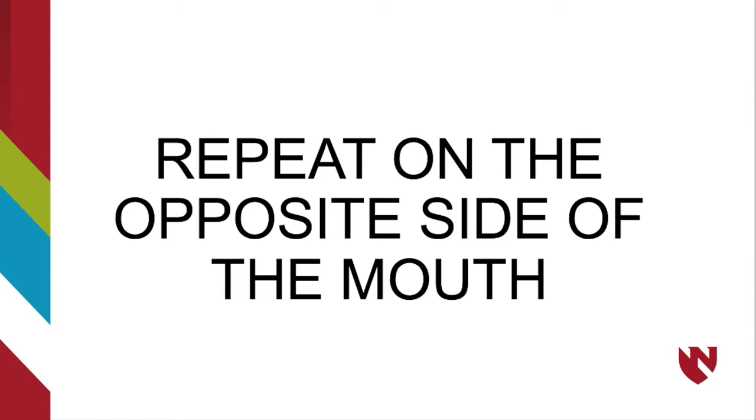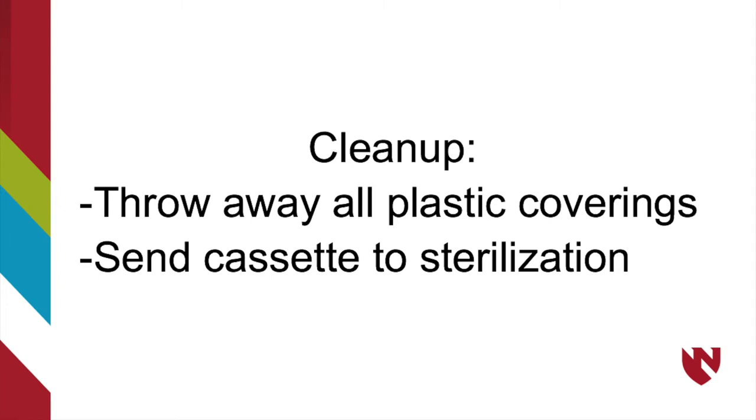Repeat these same placements on the opposite side of the mouth. Once you have captured all requested images, the patient can be dismissed.